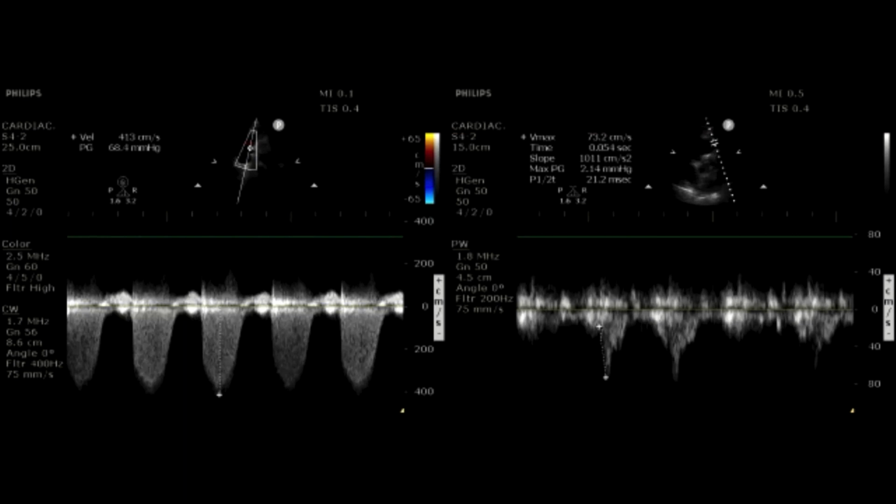So I remember I had a patient, several months ago. I mean, it was probably longer than that now, but the presumption was that the patient had a PE, right? But due to many factors that could not be overcome, we couldn't get the definitive imaging, right? And so the best I could do is some form of an echo. Assuming this is what we saw and the patient is crumping in front of us, right? They're just circling the drain and just not doing well.